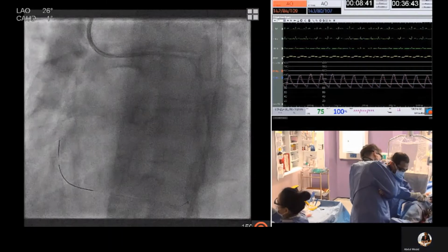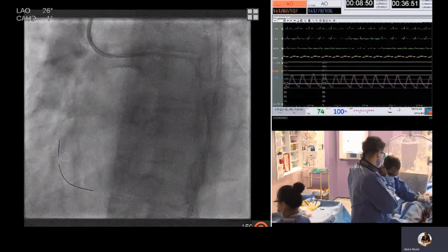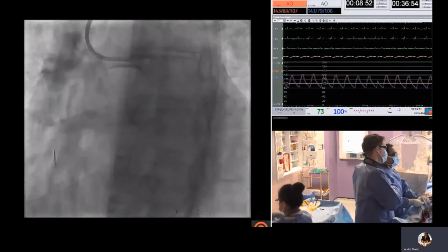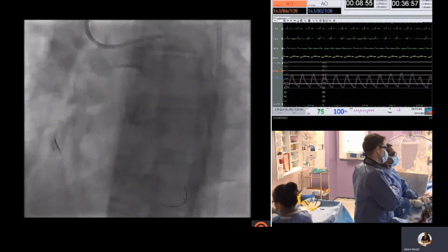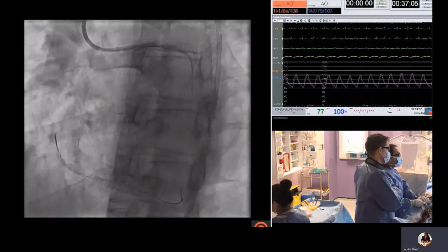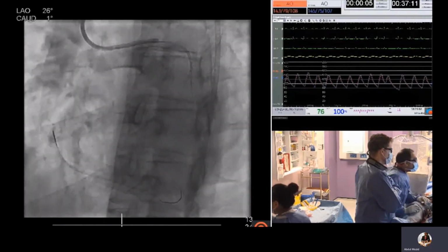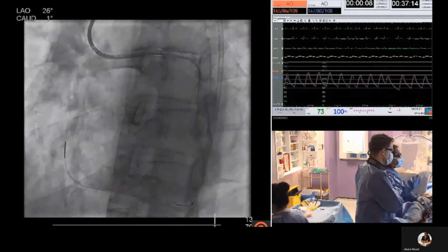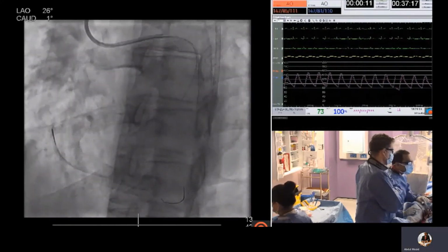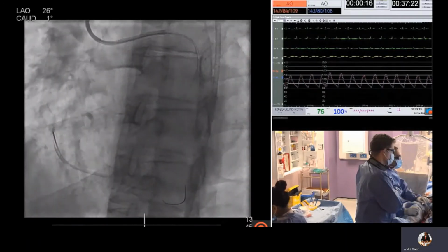So this is using a 2 ml Luer lock syringe. It's important to aspirate until you get blood into the syringe to ensure that the microcatheter is not damped, which may lead to dissection. So once you have blood aspirating, then you can inject. So here's a tip injection showing, in fact, that the retrograde wire was probably deviating into that small side branch. And in fact, we needed to take a more straight course rather than deviating to the side.